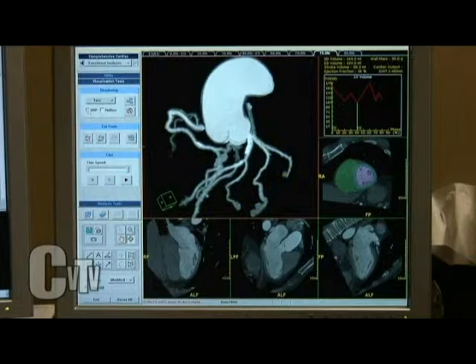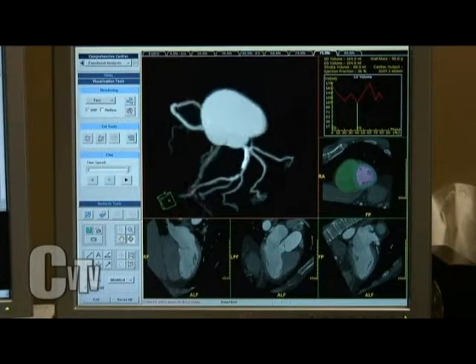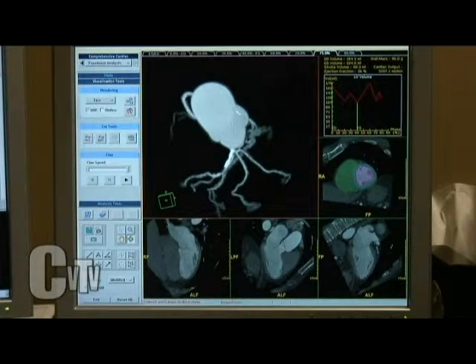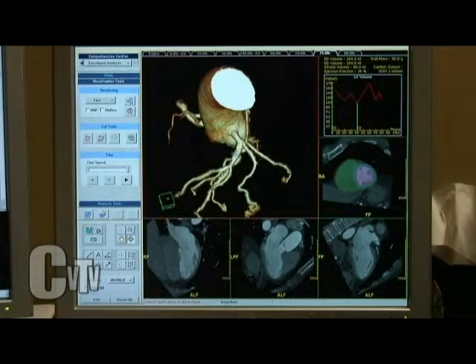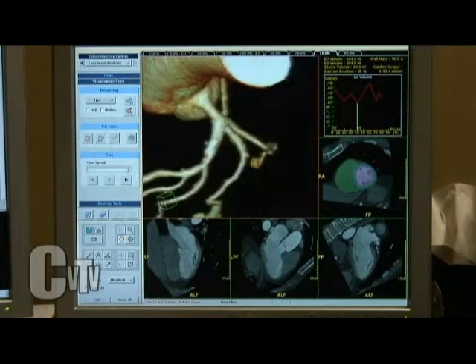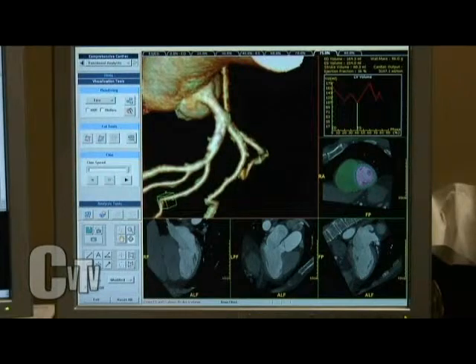We can look on the inside. This is the inside of that plaque. It's like a hydra from biology. Yep. And there's the outside. And note, this stuff is growing in the outside, fortunately for him, because that's how plaque grows. Wow. This is a long time.